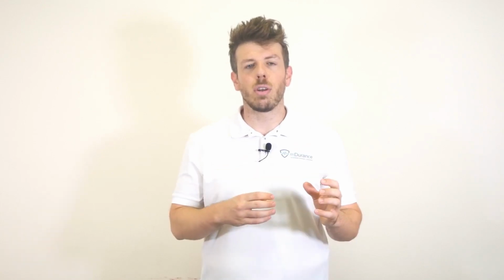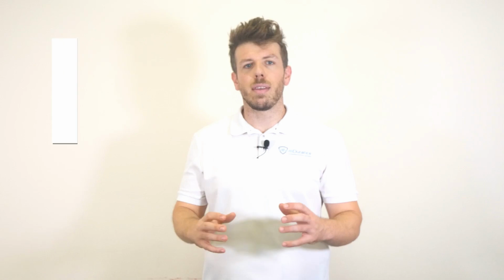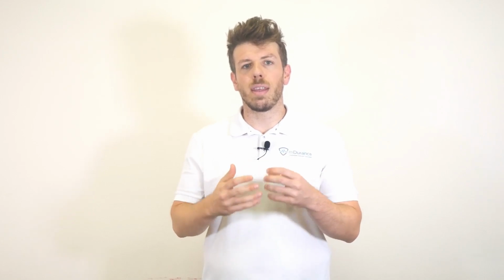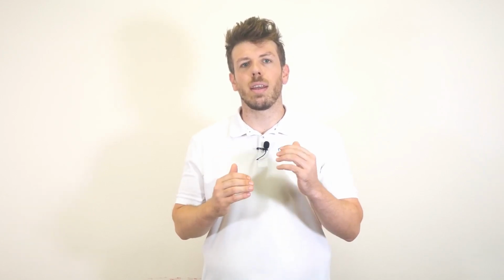The fourth test is a postural control test in a seated position. The goal is to check the ability of the SCM and upper trapezius to relax at rest. The way to perform this test is very simple. The patient sits without moving in a neutral position. Our reference will be that a relaxed muscle should be below 30 microvolts.